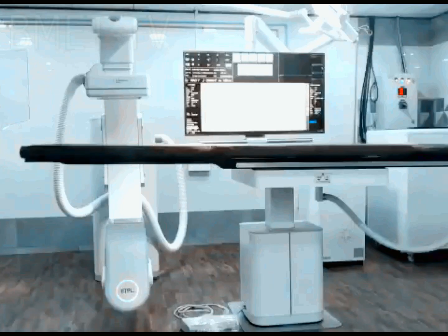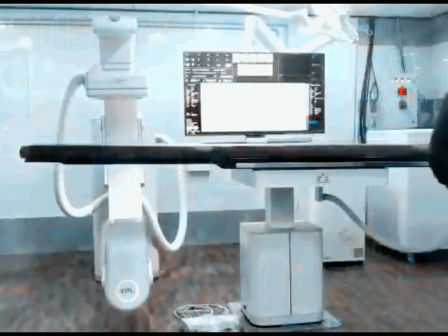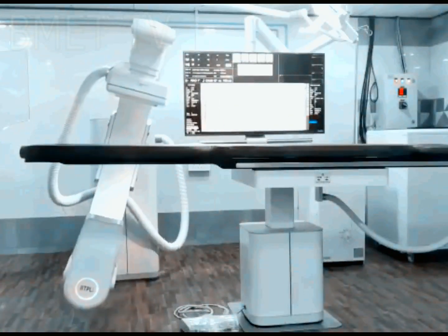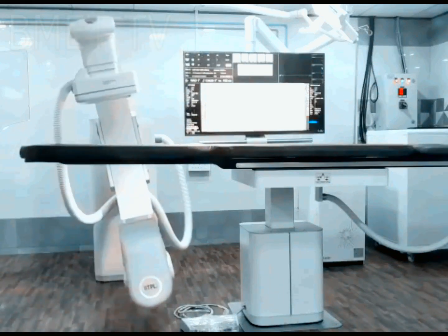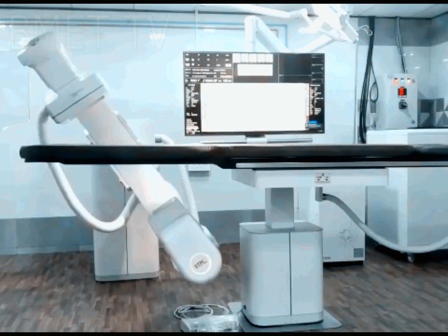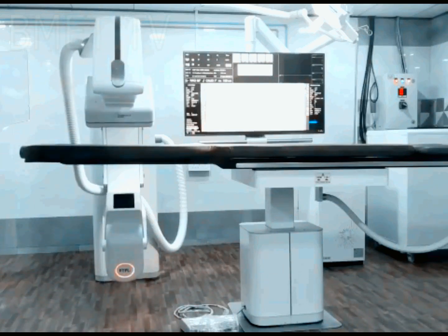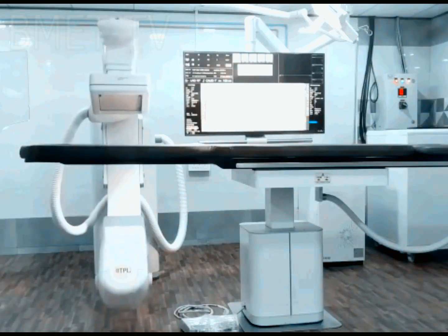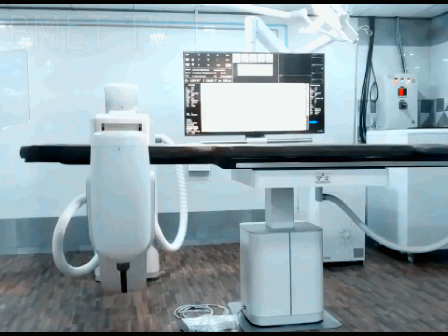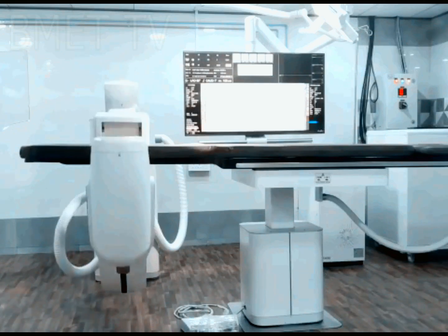Let's look into the procedure of cardiac catheterization. Procedures in the cardiac catheterization field are primarily concentrated on the study and treatment of the heart chambers, coronary arteries, and other proximal vasculature. Categories in this field may include cath labs, radiographic fluoroscopic units, digital vascular imaging systems, angiography units, cardiac catheterization equipment, and cardiac systems. When using a cath lab for angiography, recommendations and preferences refer to peripheral and abdominal vasculature cases. All 3 types of systems, cardiac catheterization equipment, general angiography units, and multipurpose systems, have different requirements regarding the C-arm assembly, image acquisition detector, image processor, and patient table characteristics.